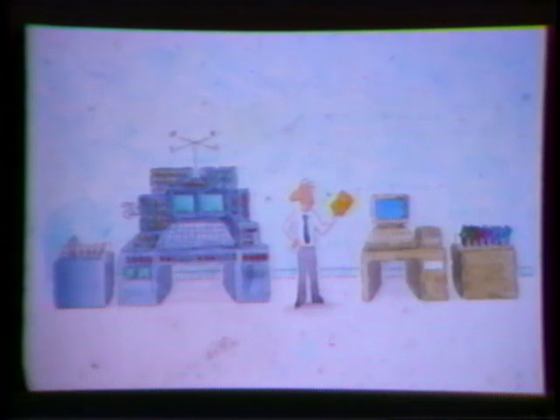Unless the buyer intends to write his own software, which is very time-consuming, a purchase decision should be based on the capabilities of the machine, which is predominantly defined by its software, and not strictly on how much hardware a manufacturer can cram into a cabinet.